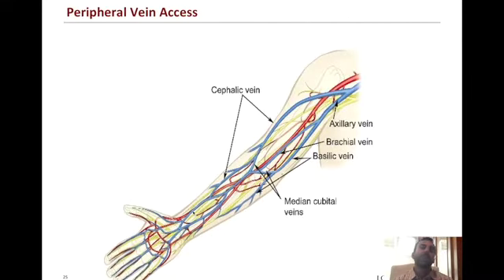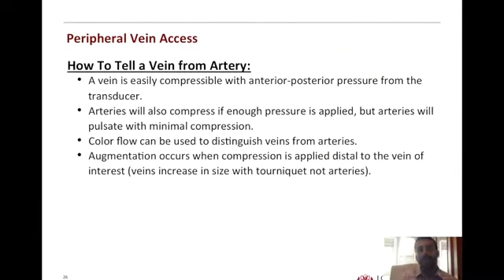So now let's spend some time talking about peripheral venous access, and I think this is the area where ultrasound is going to have a growing area of utility. Many folks have the ability of honing in their skills for the distal venous access and any vein that we can visualize. However, there are deeper upper extremity veins that are not able to be visually assessed, but with ultrasound they allow us to get pictures that would potentially allow us new avenues of where we could gain access. So again, I would encourage this.